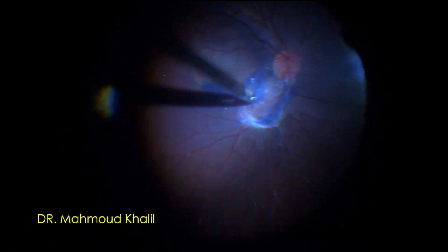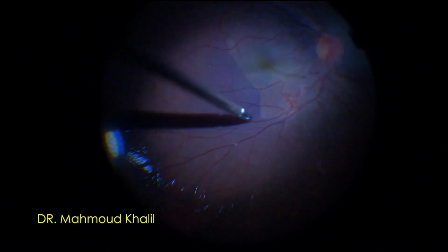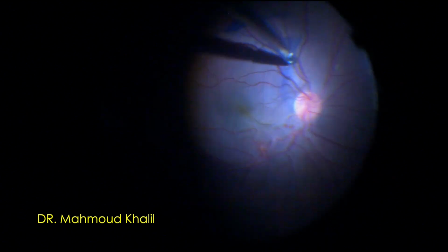After removing the posterior hyaloid, then we will start to remove the ILM before removing the epiretinal membrane. When removing the ILM, the epiretinal membrane overlying the ILM will come out with the removal of the ILM, and then increasing the area of ILM removal.